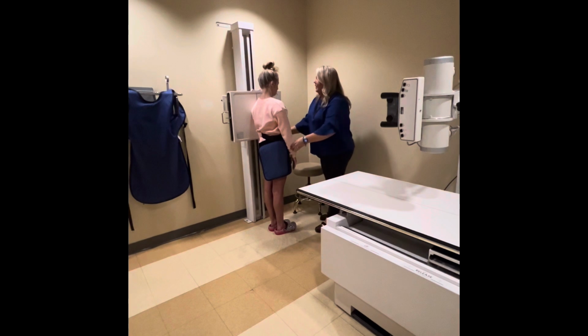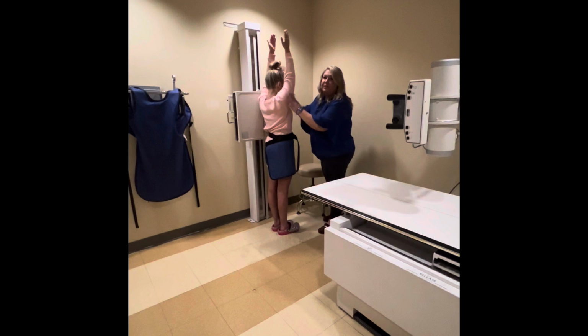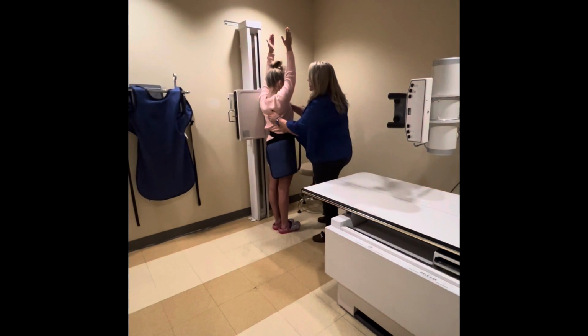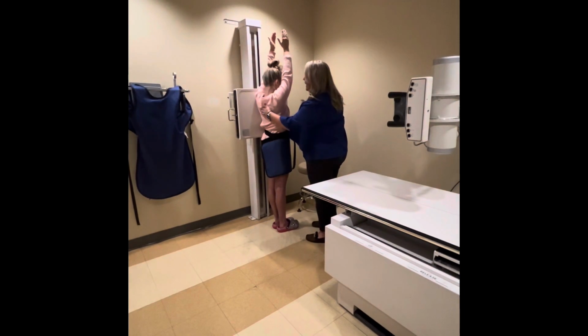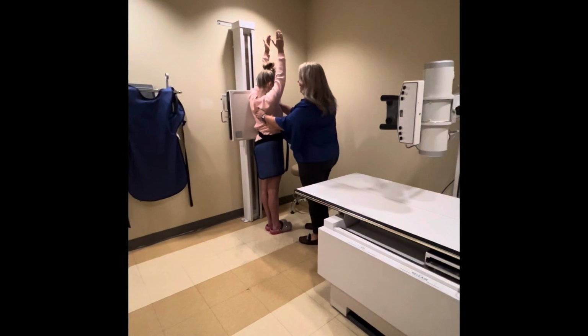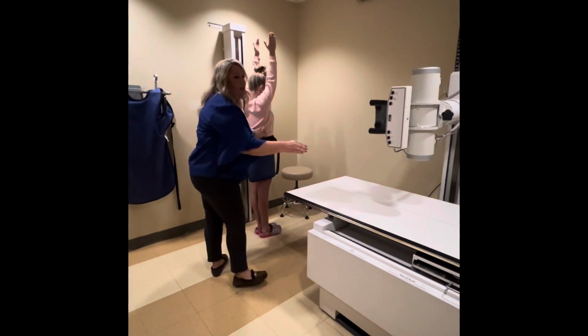Okay? I'm also going to have you raise your arms so that the soft tissue of the arms and the bones of the humerus do not obscure the lung field. She's also going to step right up against that board. I'm going to put my hand across her back to make sure that her ribs are superimposed on one another and that she's not rotated in either way. We're going to turn the light on.